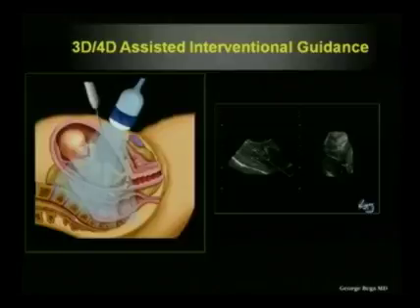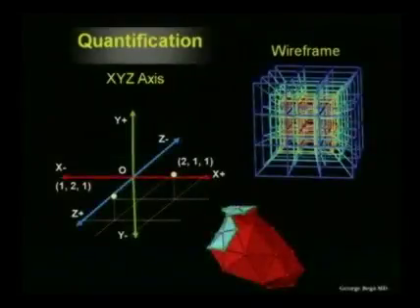This is still in its infancy. Much more work will need to be done, but both multiplanar and render displays can assist and are great, especially in visualizing the target or otherwise the coronal plane. This is what we normally miss. We don't have access to the target or to the coronal plane. Far more work will need to actually be done by both the industry and the academia to come up with some standard forms of interventional guidance. But otherwise, in our own experience, this is really a very exciting and useful tool.